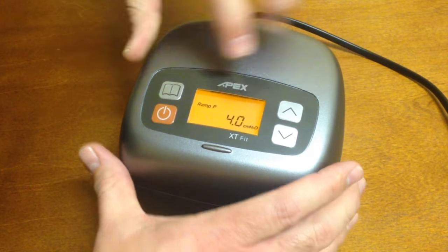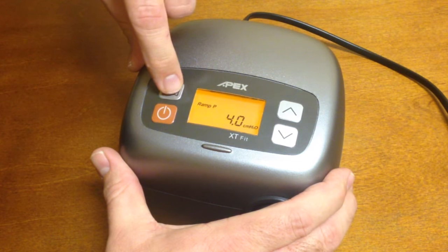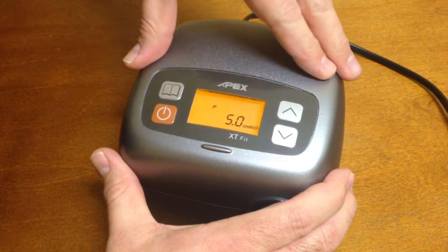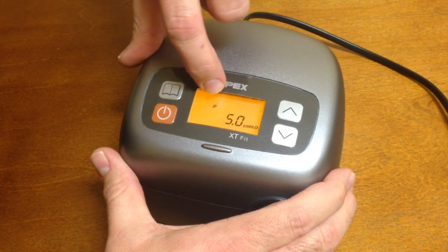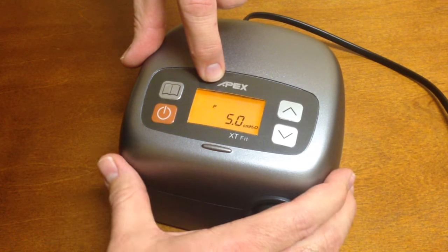Then you can set your desired ramp start pressure. Once you have that, press the book button to set that change in, then press the book button again to go to the next. Here it just shows 'P' — that's the standard CPAP pressure, where 'Ramp P' is the starting ramp pressure.